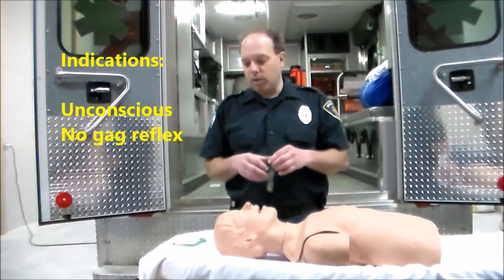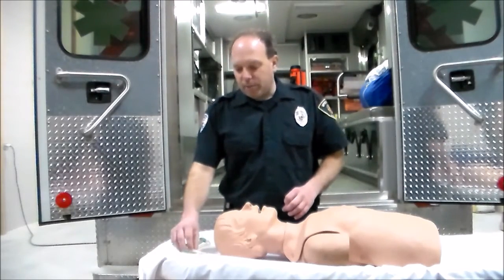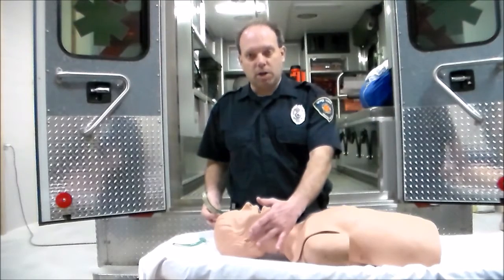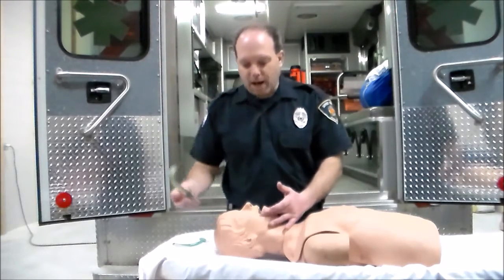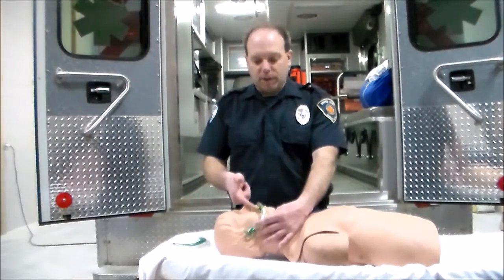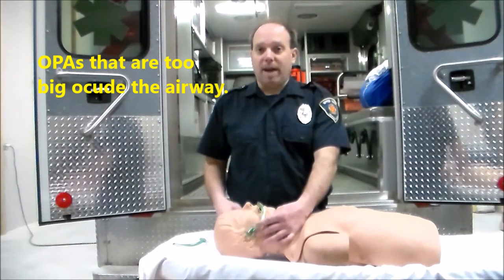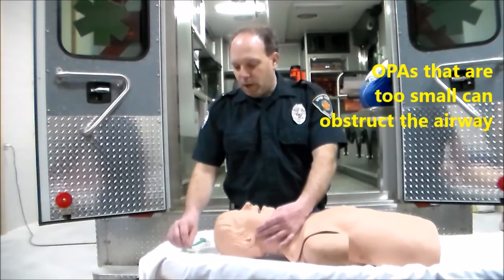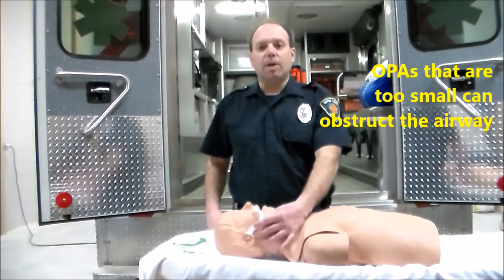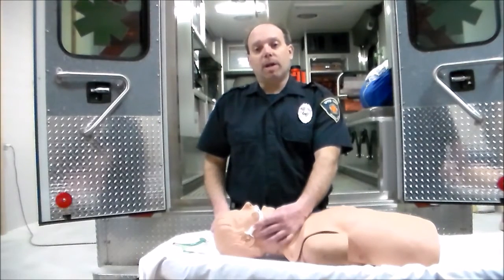An oral airway is designed to control the tongue. The best way to measure it is from the tragus of the ear to the corner of the mouth. When I place this one in line, you'll notice this one is a little bit too big — if it's too big, it may actually occlude the airway. Going to the next size, from the tragus of the ear to the corner of the mouth, we note that this is the correct size.